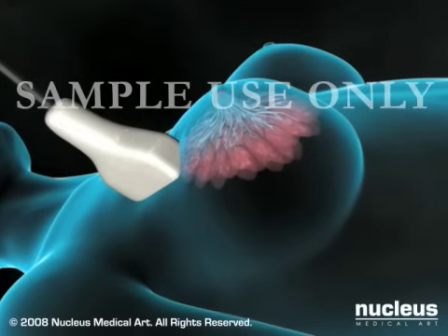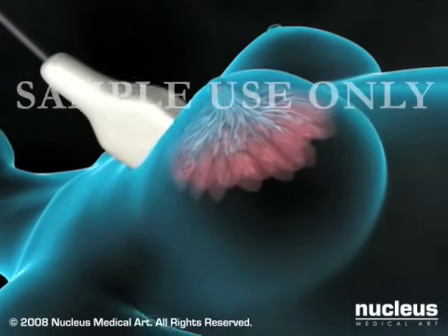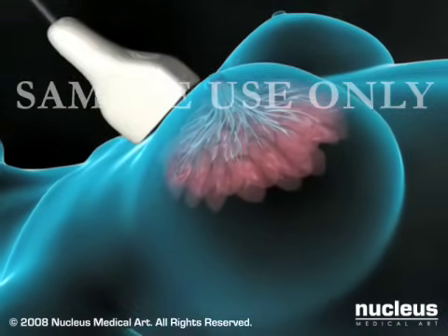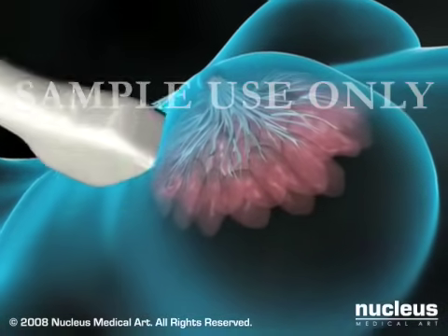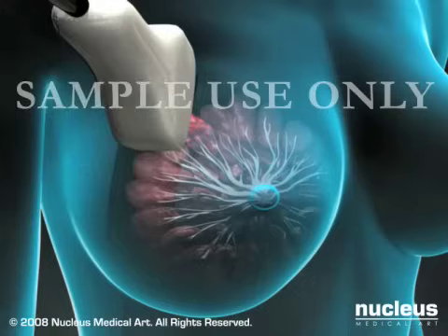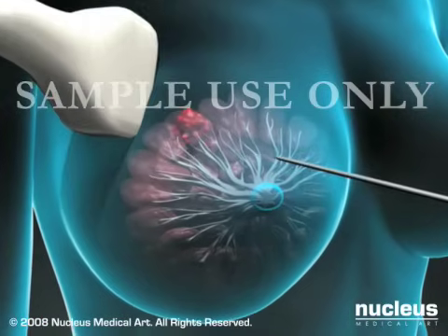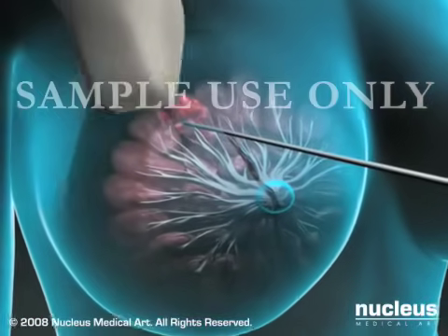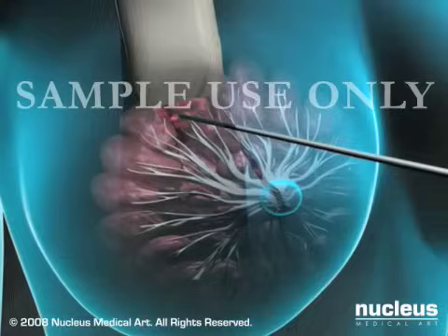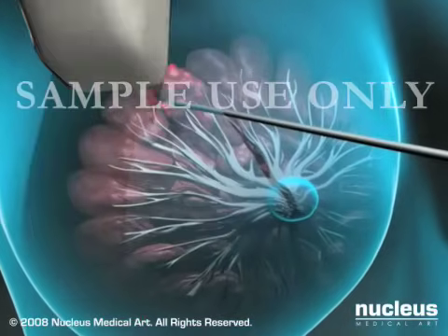Ultrasound-guided core biopsies can be performed when your breast mass is detected on ultrasound. In this procedure, your physician will use an ultrasound probe to locate the mass and insert a hollow needle to remove several cores of tissue.